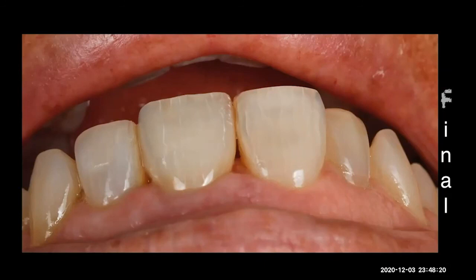Like when we build ceramic, I built ceramic for 15 years. That's why I have my eye trained in color and in what I need to use and what I don't need to use. So check, this is a difficult case that I did with a crown that is 95% monolithic. I did all my movement with different colors and different ceramics, but it's ingot selection. Ingot selection is really, really important.